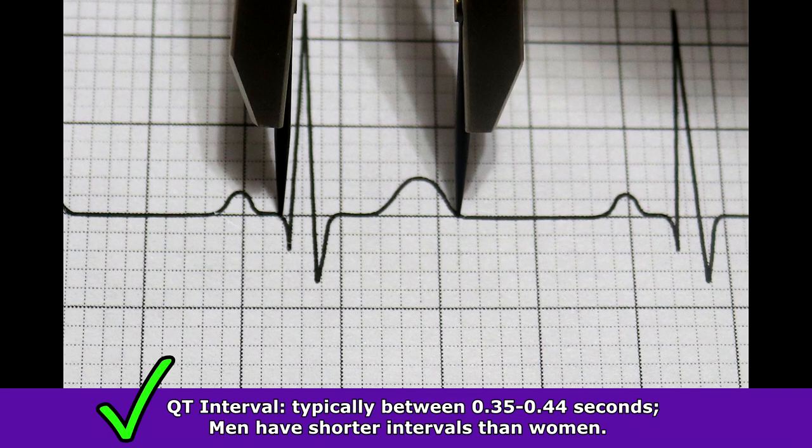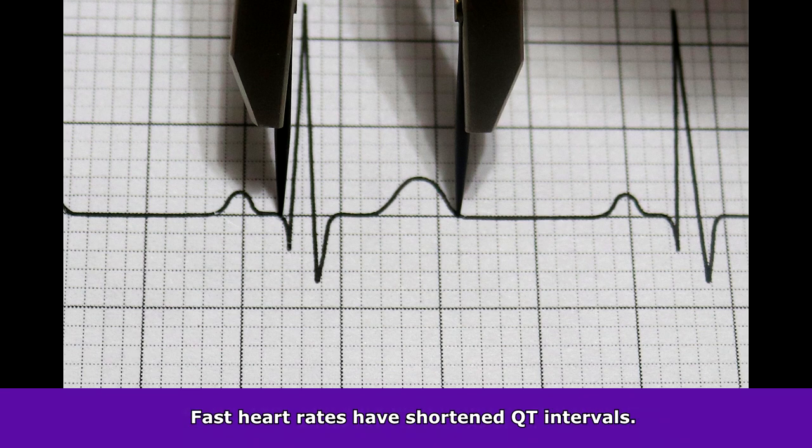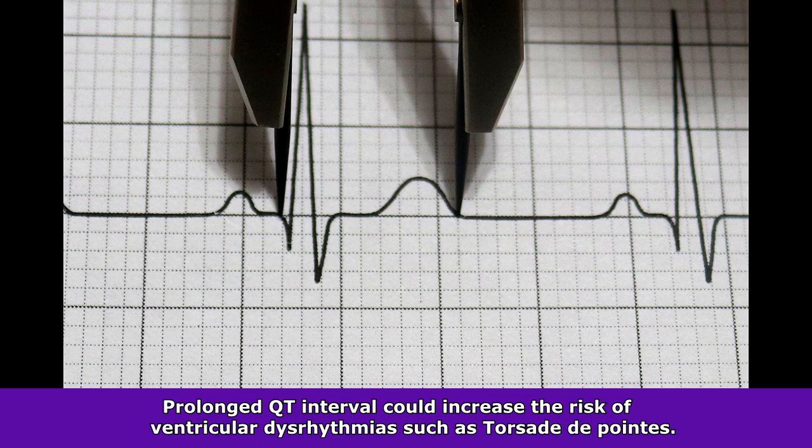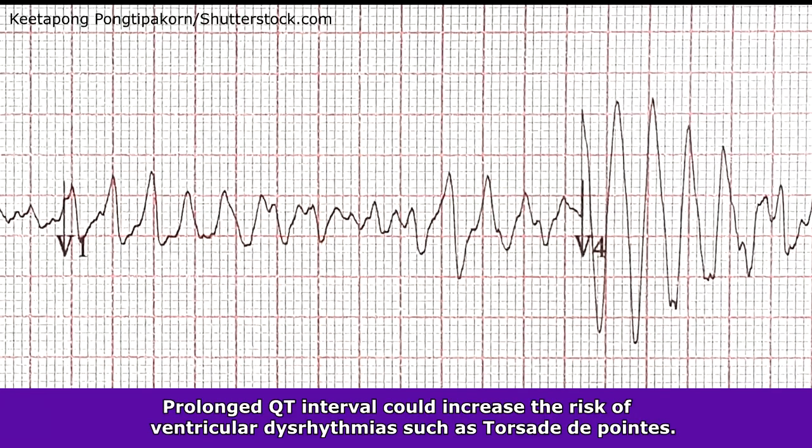Typically, it's anywhere between 0.35 to 0.44 seconds, and men have shorter intervals than women, and it really varies depending on if it's a fast heart rate or a slow heart rate. Fast heart rates have shortened QT intervals, and a prolonged one could increase the risk of ventricular dysrhythmias, like torsades de pointes.